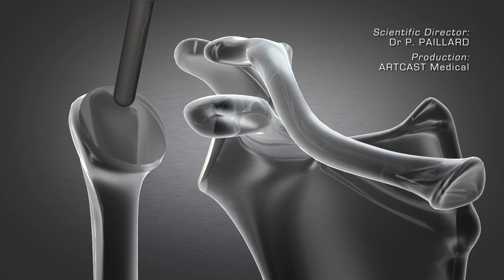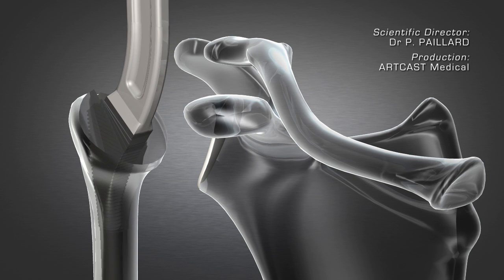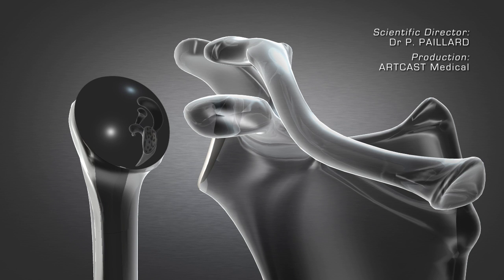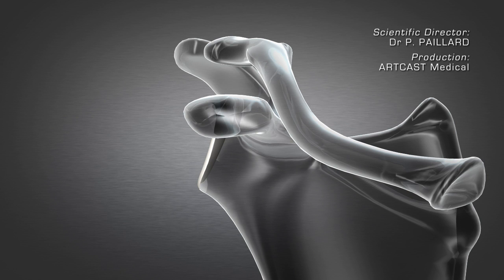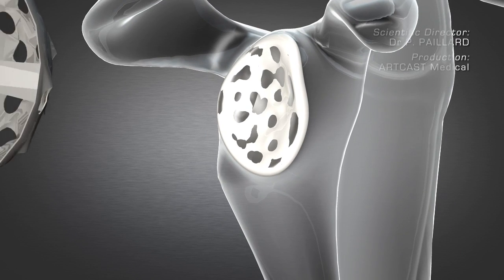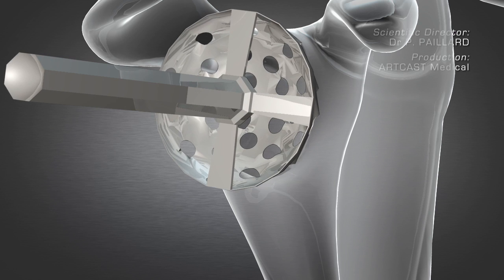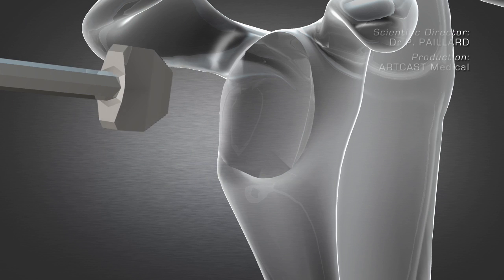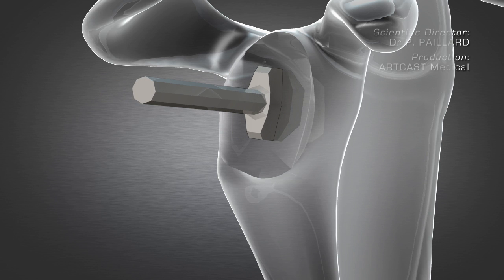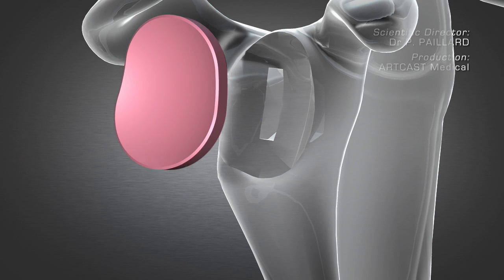Different rasps are used to prepare the surface for the insertion of the humeral implant. The glenoid cavity is then exposed and the bone is specifically prepared using different cutters. The implant is then set into place.